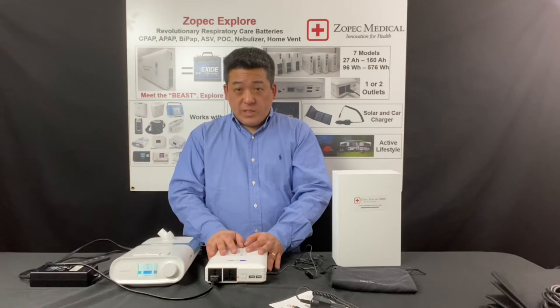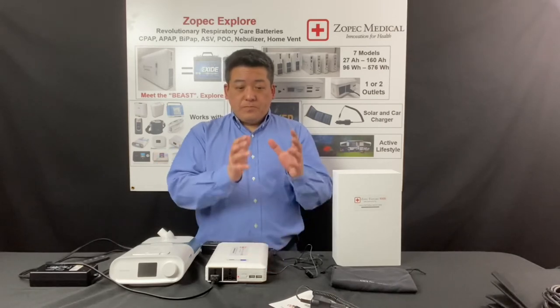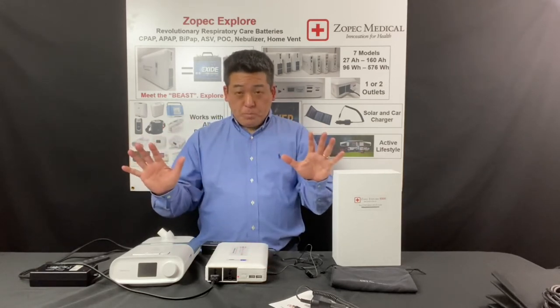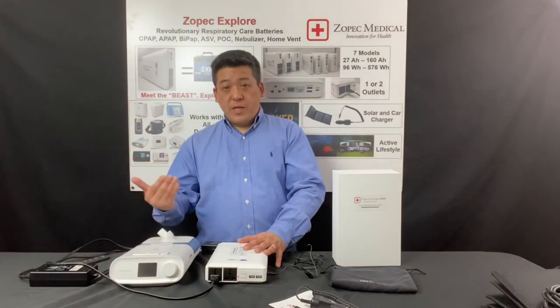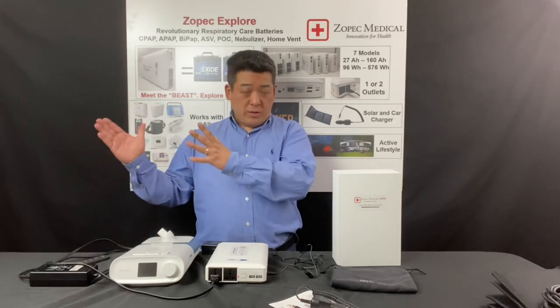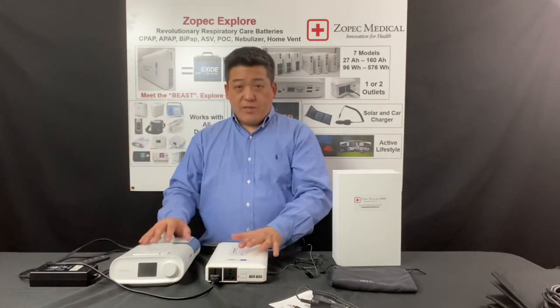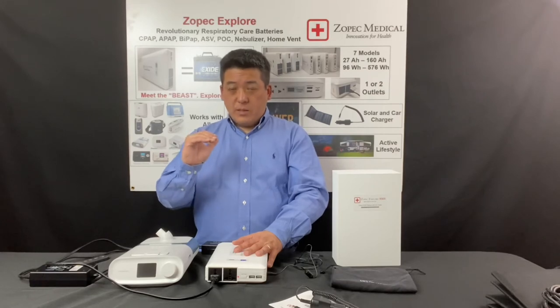For the Explore 8000, the UPS level is what we call gold. It can handle a CPAP or BiPAP machine and humidifier from low to mid-level, but not higher, and not with a heated tube. If you want to run humidifier at max or with a heated tube, you need to upgrade to the Platinum UPS, which is the Explore Oxygen or the BEAST. The BEAST can handle pretty much all settings of CPAP and BiPAP with humidifier and heated hose. But the Explore 8000 supports any CPAP or BiPAP setting with humidifier only at low to mid-setting and no heated tube.